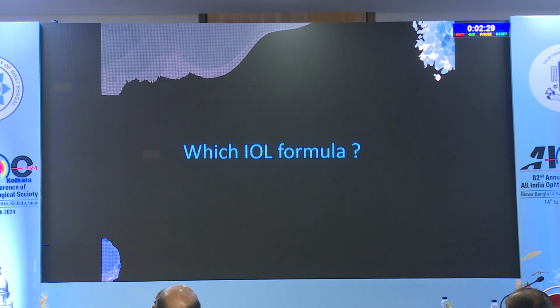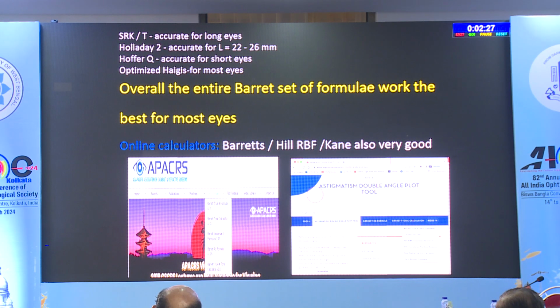Now, which IOL formula? This has been very well covered by Dr. Bhalla earlier. Barrett has made our life very, very easy. We don't have to bother much about it.